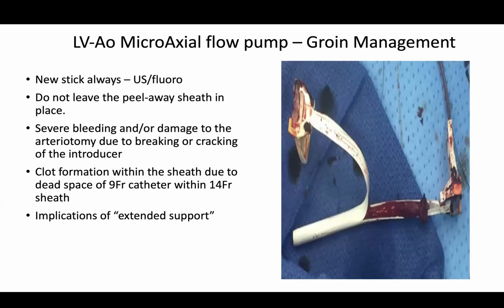So groin management, I think John talked a little bit about this. But this slide talks about patients coming from, for example, if I'm on call at Greenwich and I'll put a balloon pump in, but we think someone needs to be upgraded, what needs to be done? So the first thing that you should do is get a new stick. So do not rewire the balloon pump and deal with that groin. You get a new stick using ultrasound, fluoroscopy guidance.